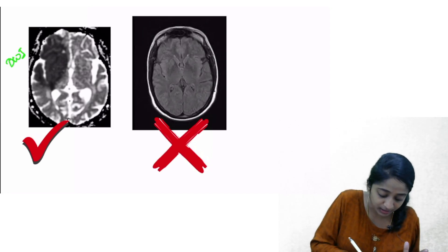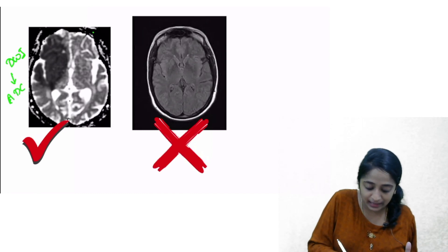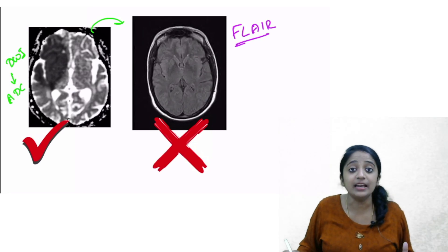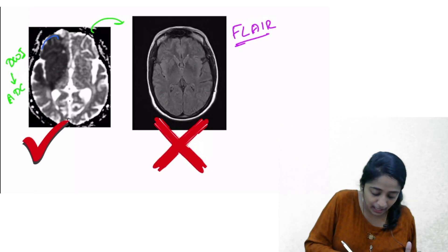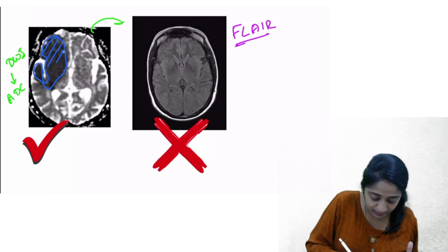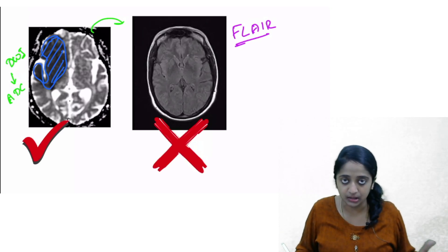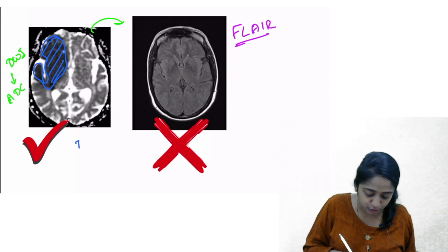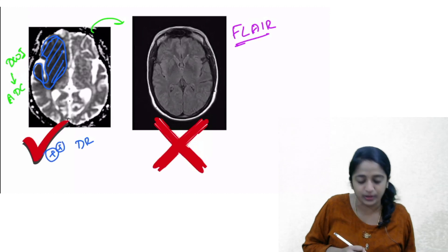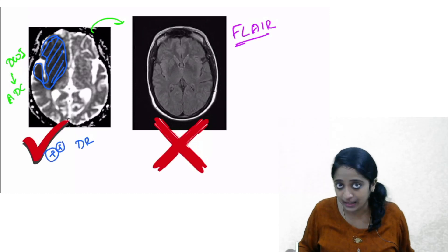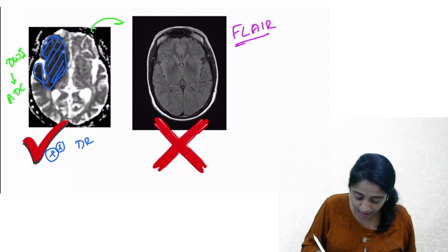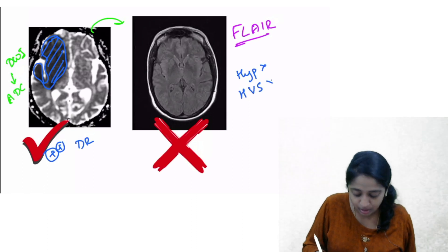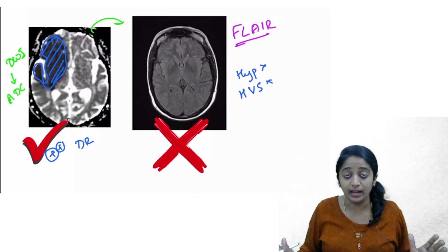In the ADC map, I'm seeing hypointensity following a territorial pattern involving the cortex and white matter. The corresponding diffusion-weighted image is bright — so I call it diffusion restriction. There is change in the diffusion-weighted sequence. Now looking at the FLAIR image, am I seeing hyperintensity? No. Am I seeing the hyperintense vessel sign? Again, no. So there is no change in FLAIR — FLAIR appears apparently normal.